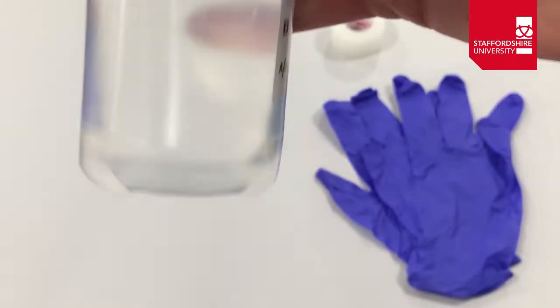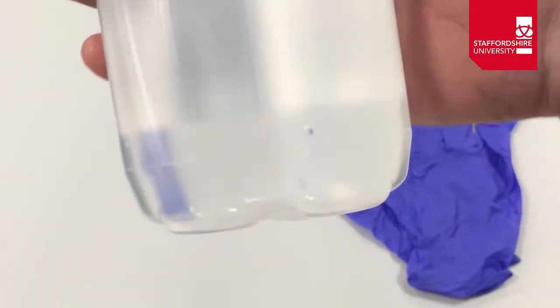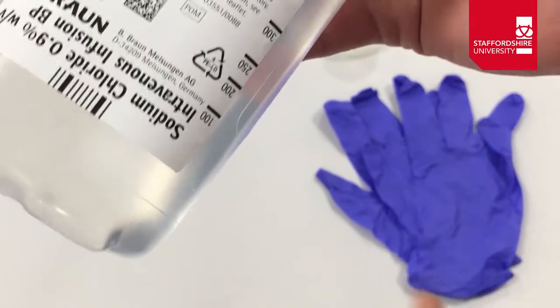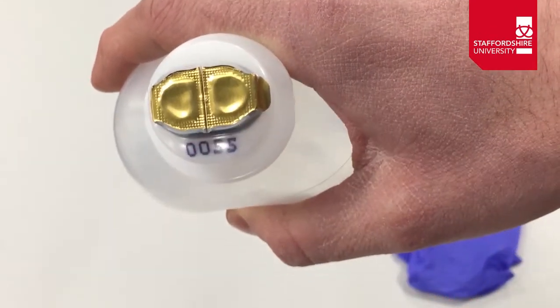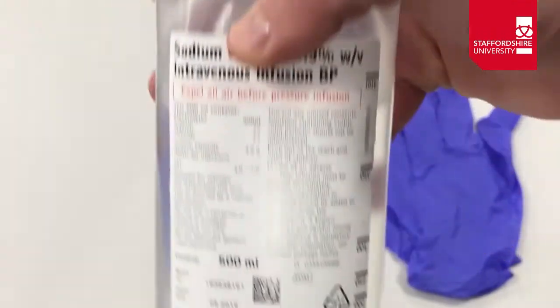We'll look at the fluid itself and check for clarity — no particulates floating around, nothing out of the ordinary. Check the packaging for any holes. We're also going to check that the covers are present on the administration port to confirm there's been no tampering prior to us using the fluid.